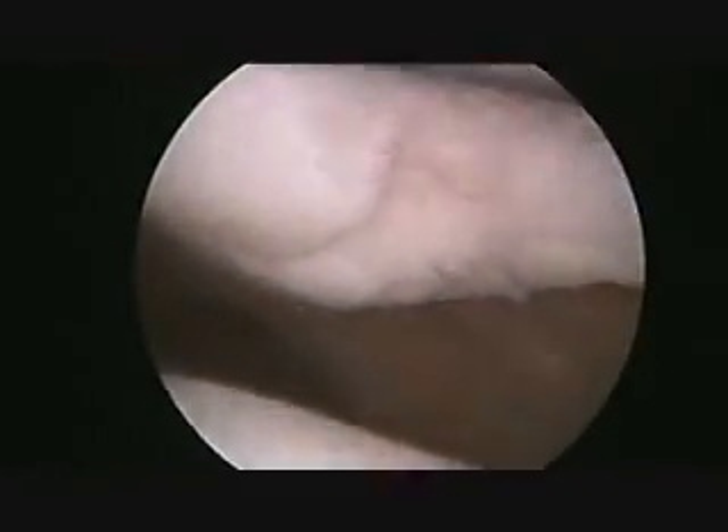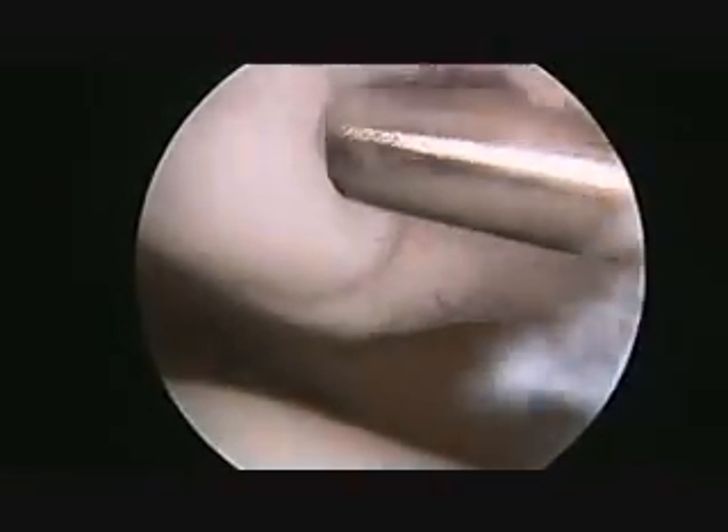Once it is completely cleaned and smoothed, any other additional surgery in the knee is completed. The arthroscope is then removed, the wounds are closed, and the rehab can begin.